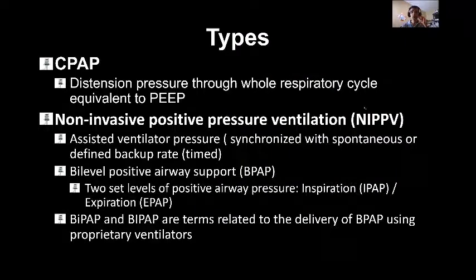So what are the types of non-invasive ventilation? The first non-invasive ventilation is CPAP. What is CPAP? CPAP is continuous positive airway pressure. What does that mean? Continuous positive airway pressure is any pressure above atmospheric pressure.